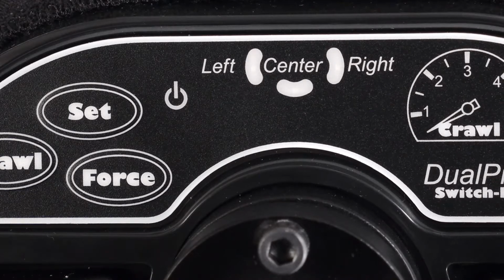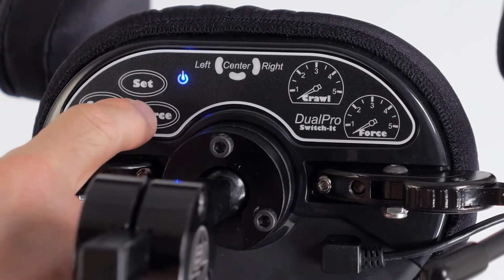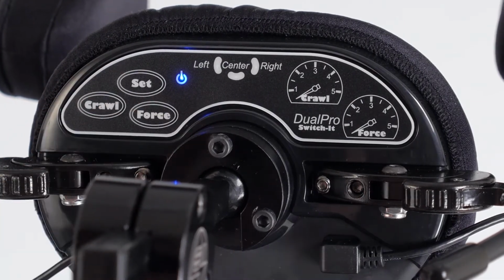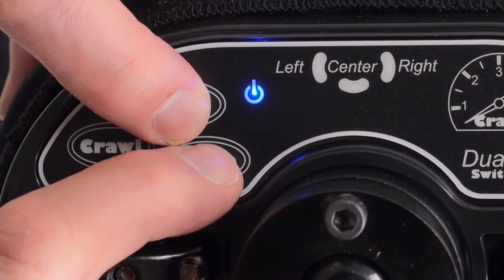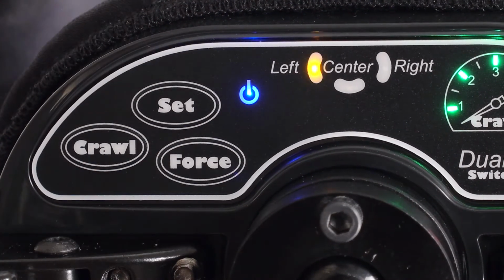When the system is turned on, a single blue power light indicates that the head array is operational. In its normal operating mode, the entire back panel is locked out and the buttons will not respond to touch. To enter the programming mode, press Set and Force at the same time for 3 seconds until the left pad indicator light starts flashing. In this programming mode, the left pad can now be programmed.